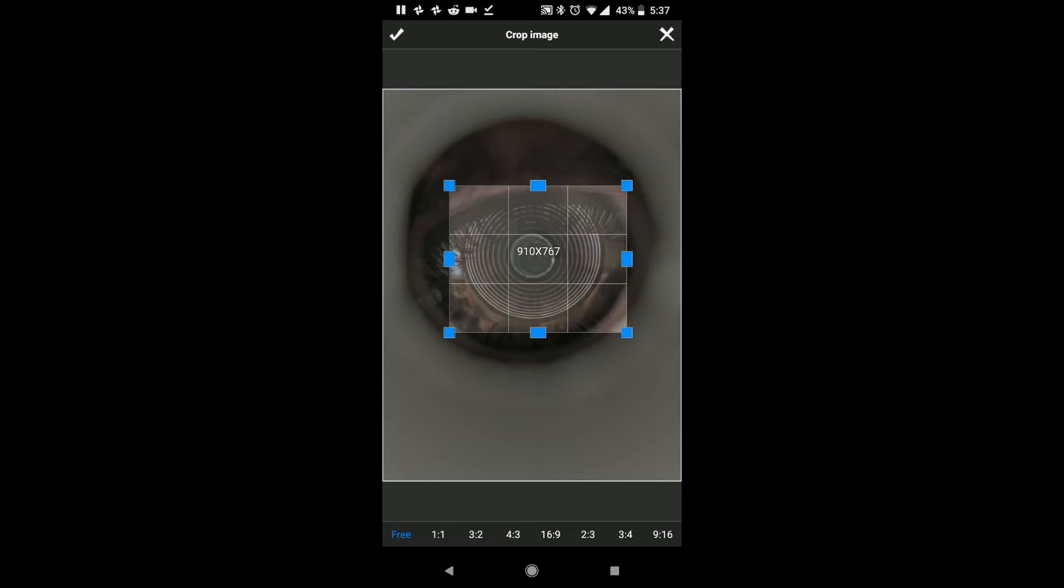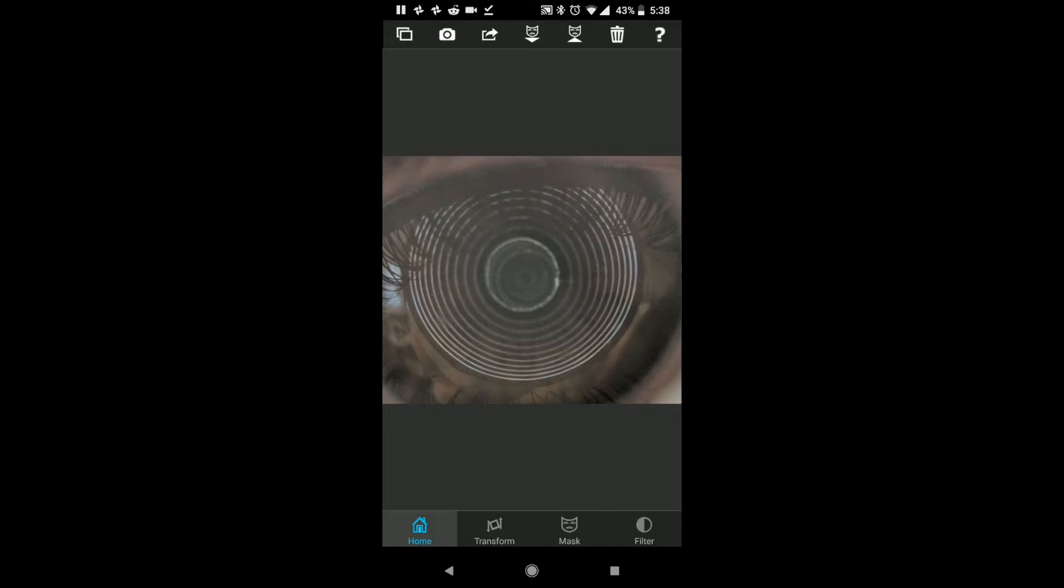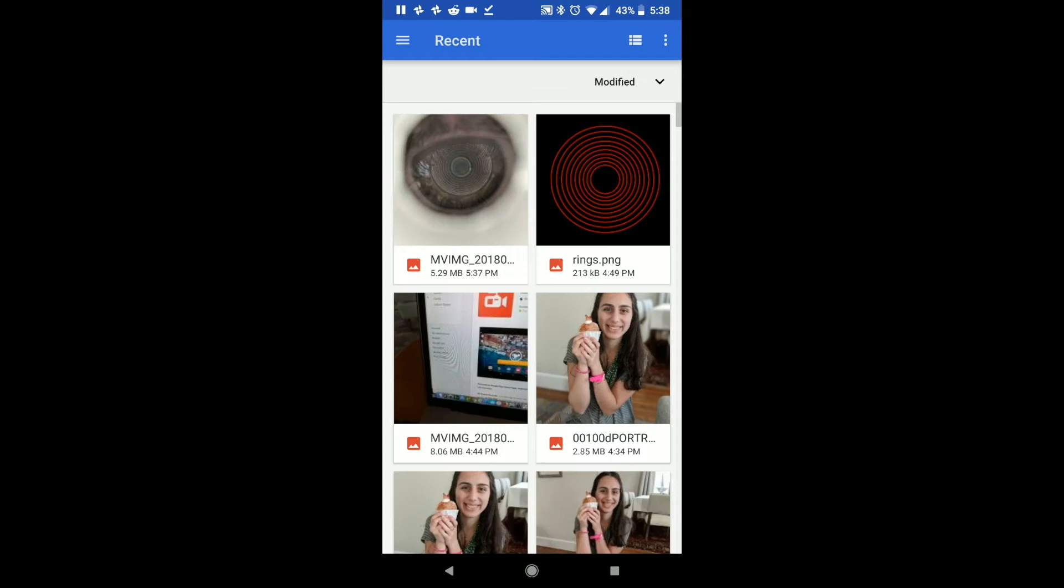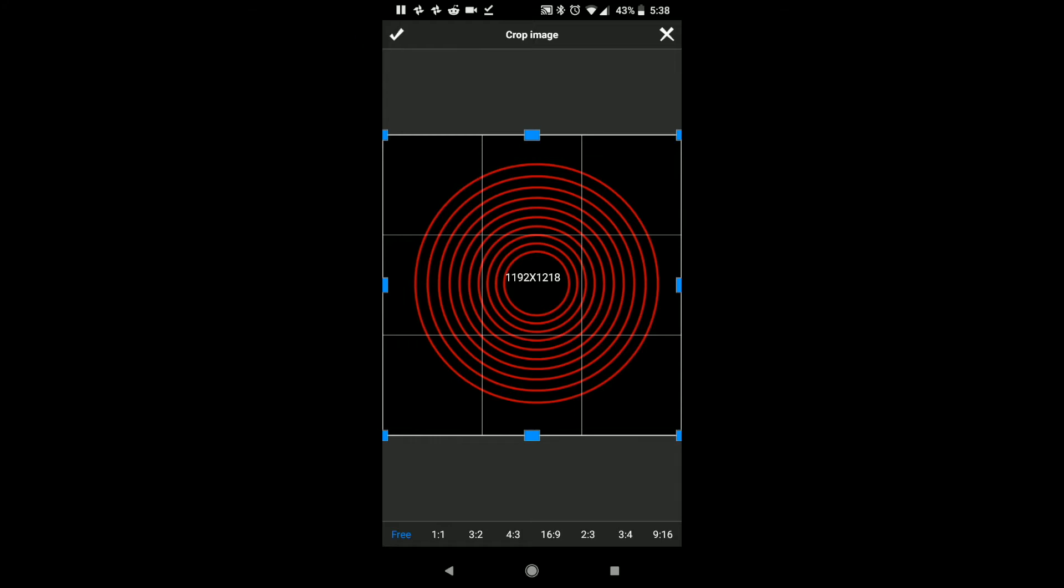Now, what we want to do is we want to superimpose upon it the rings, the ring pattern that was used in the Placido disk part of the photokeratoscope, so we're going to do the same thing. We're going to go to that upper left-hand corner, and now we're going to import a foreground, and I'm going to go to gallery, and you need a file called rings.png, which I shall send you.